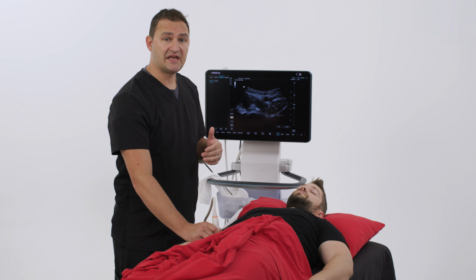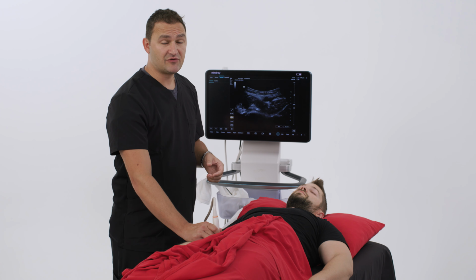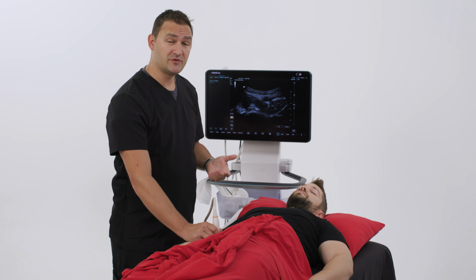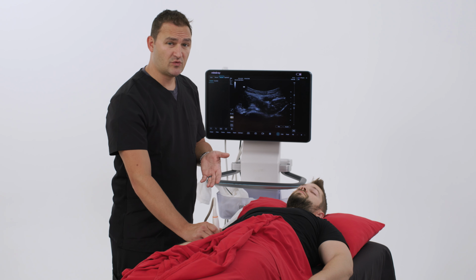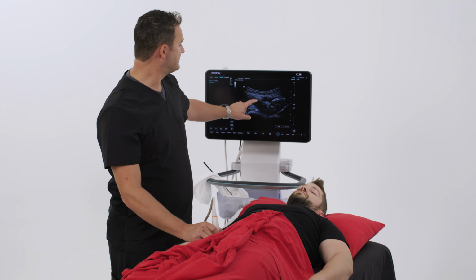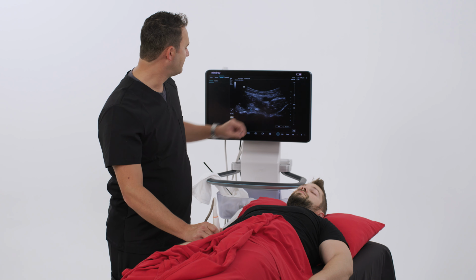I like using a 10 cc syringe while injecting this block because it's a lot easier to inject at higher pressures. This goes against everything that we're normally taught when we talk about regional anesthesia, because we talk about not having high pressures when we're injecting. This is one of the exceptions to the rule. It should be a little bit challenging to inject because this is a very tight space between the bony structures and the fascia and the muscle there.